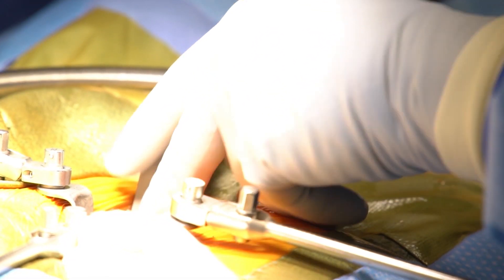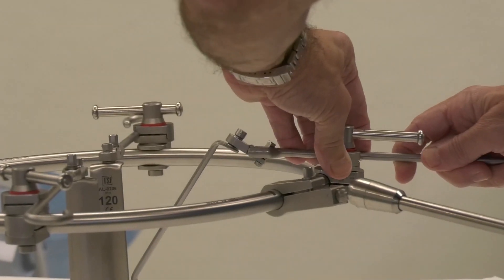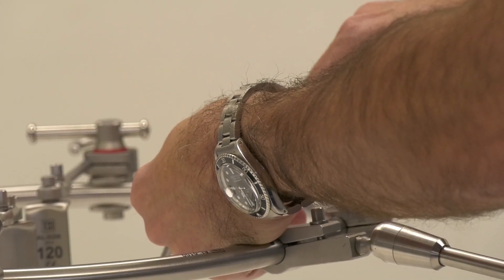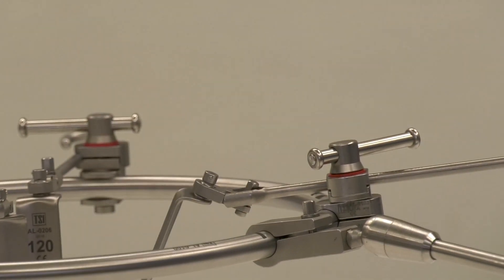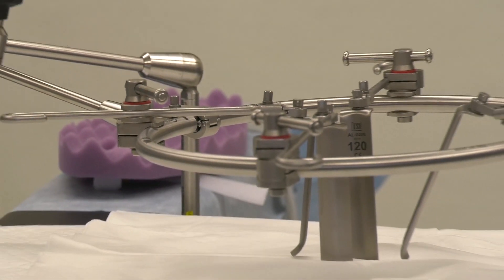That higher degree of angulation is to allow this to fit into the pelvis, or down into the pelvis, right on top of the sacrum. And that's your basic setup for the retractor blades.